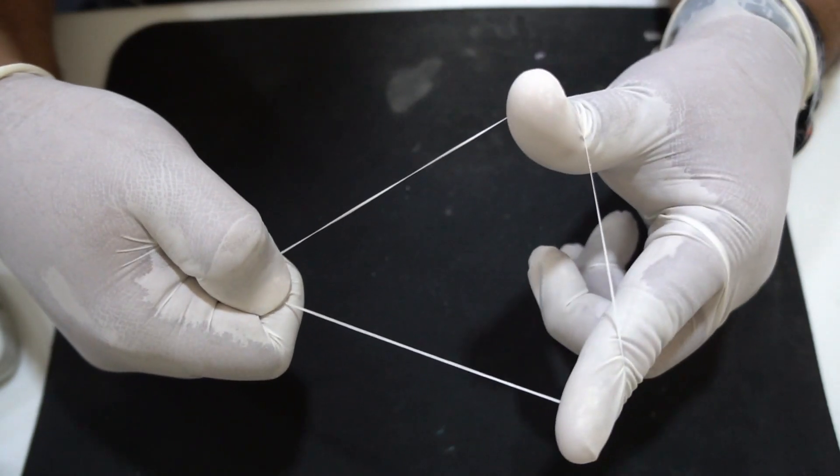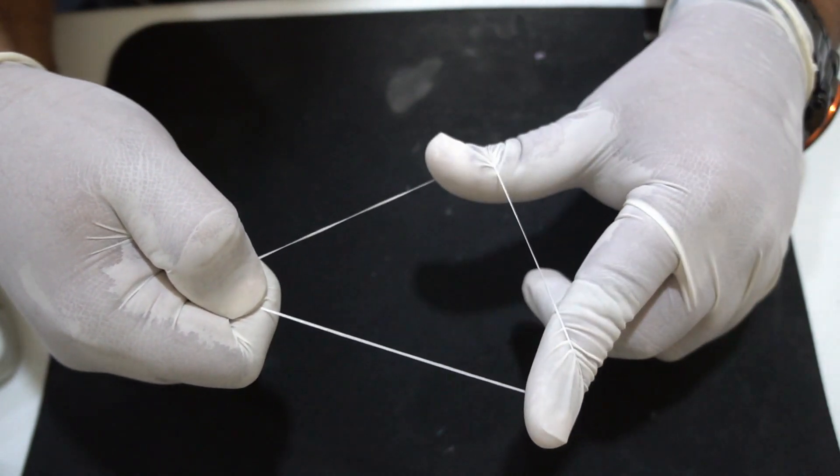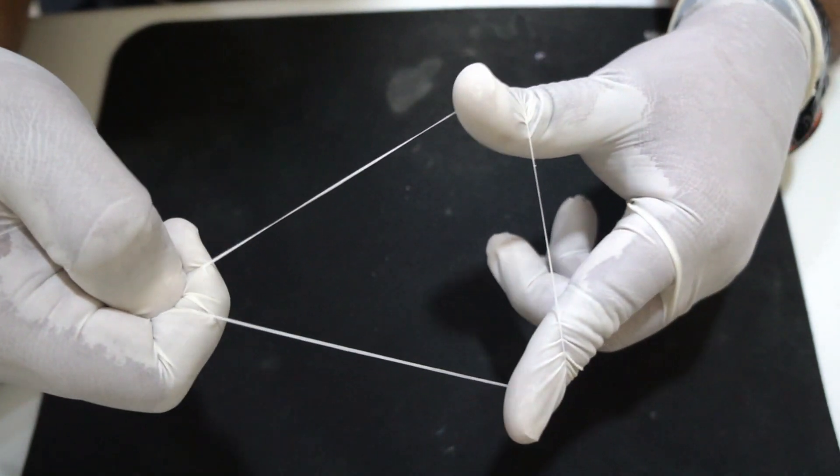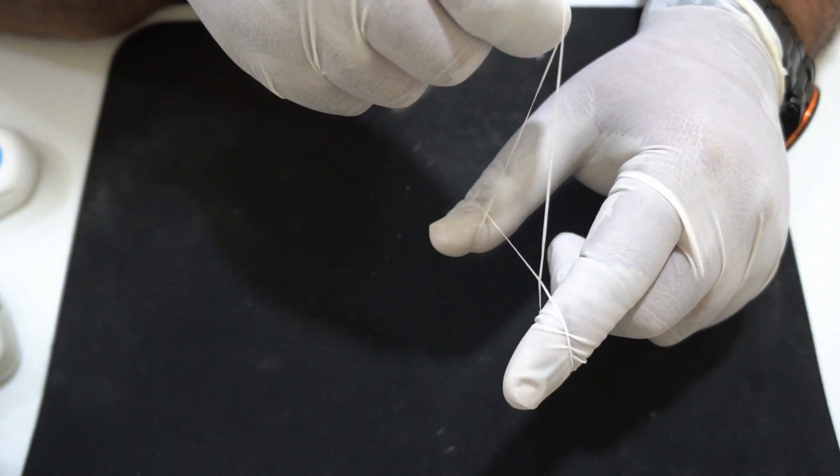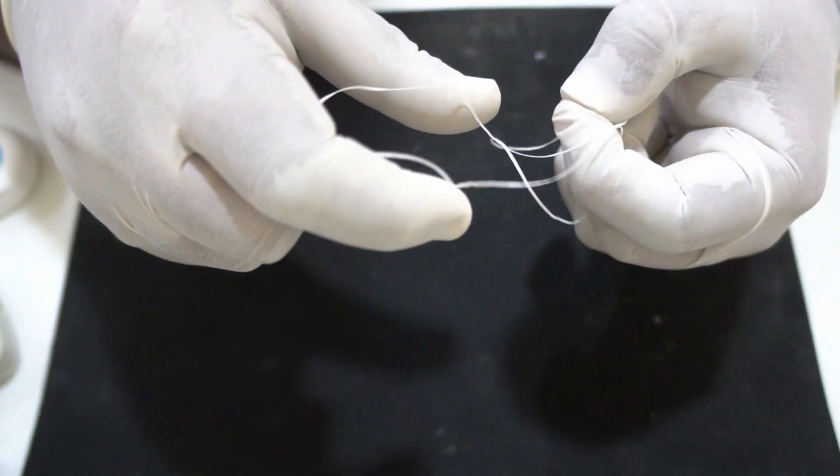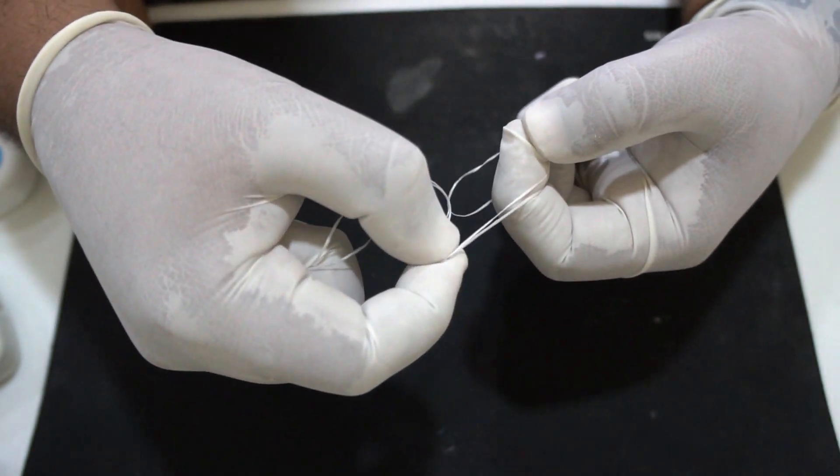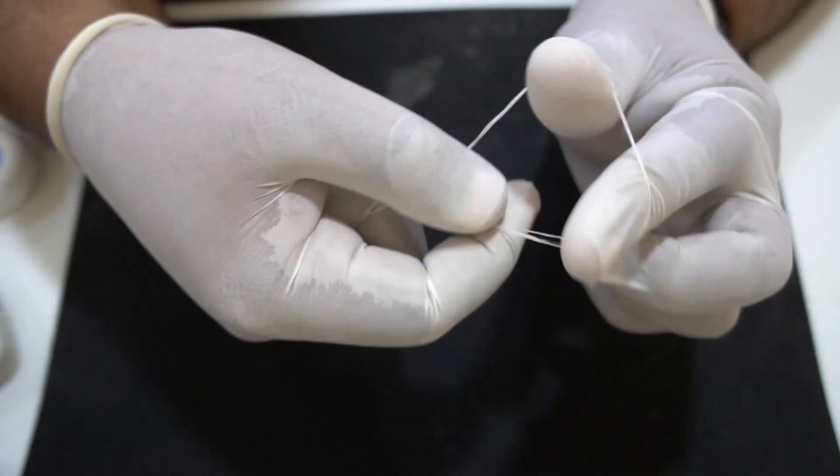On the left hand you should stretch the floss between your index finger and your thumb. Now move the floss from the right side to the left side like this. Join the index finger and the thumb. Move the floss from the thumb to the index finger. Now you have a double thickness stretch of floss.